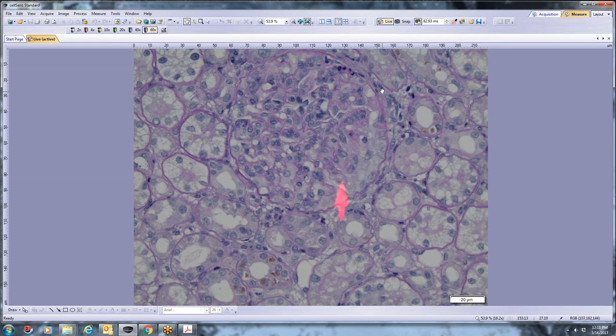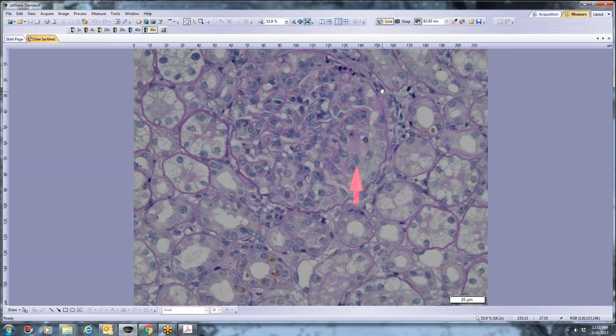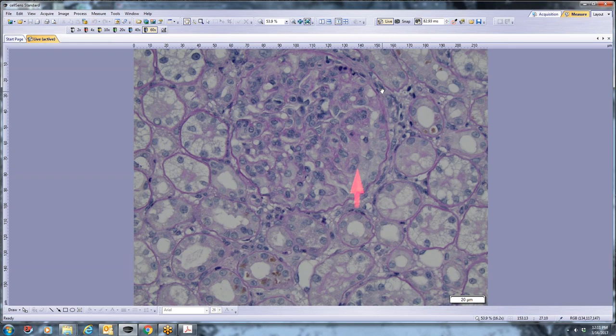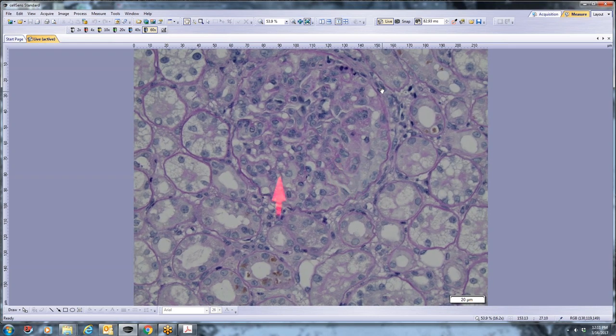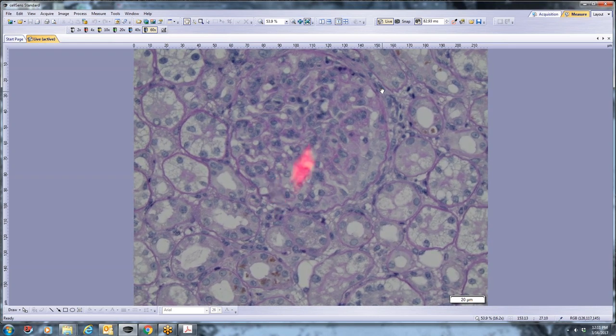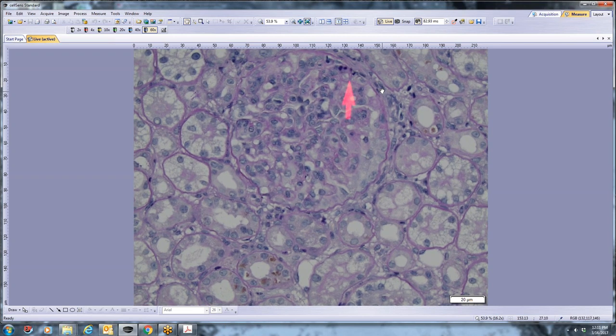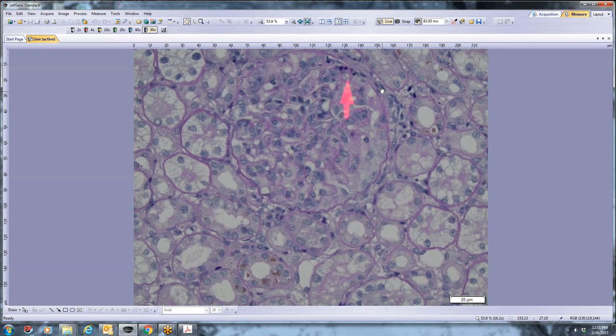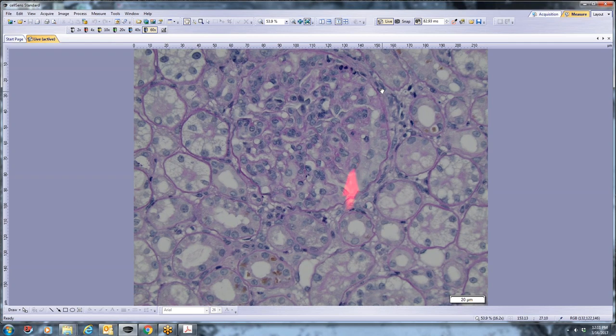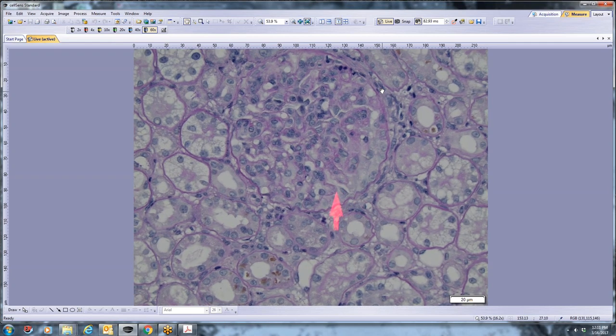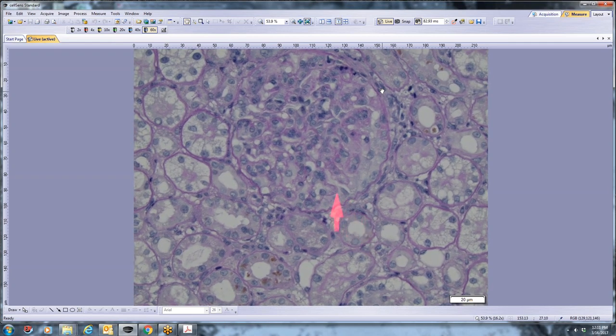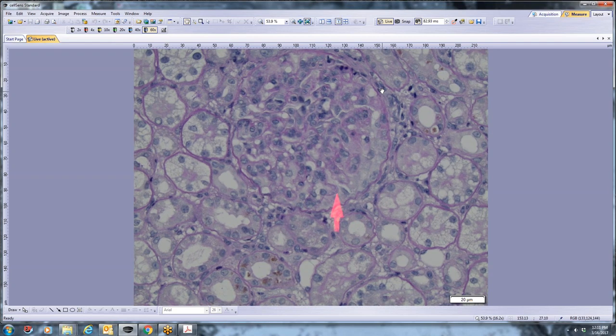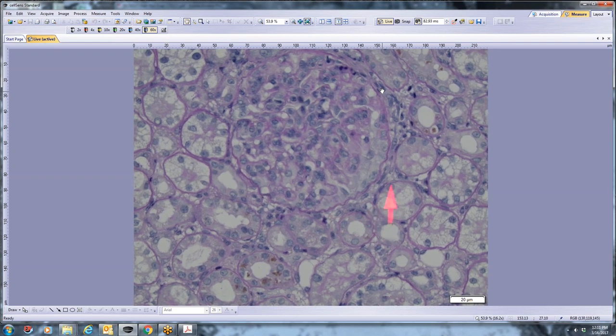So all of these cells are inside the lumens. There's also some degree of mesangial hypercellularity. And then the actual capillary walls, this tiny thin line is actually still the glomerular basement membrane. So in general, the capillary walls aren't very thickened yet.